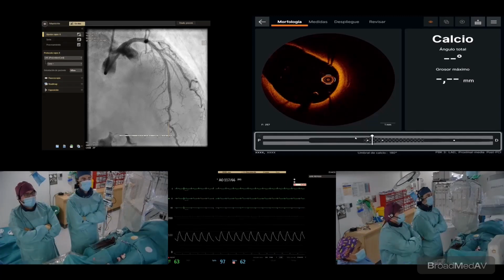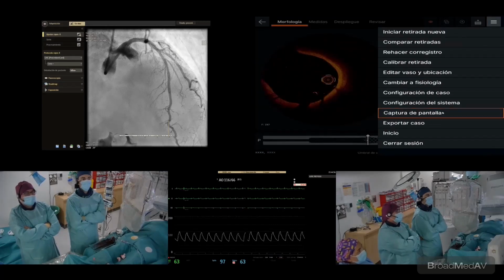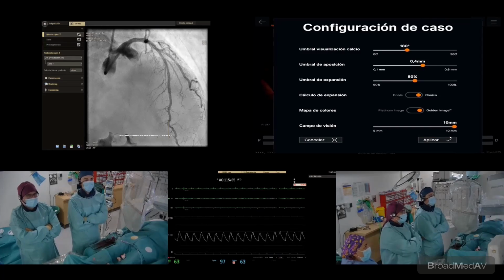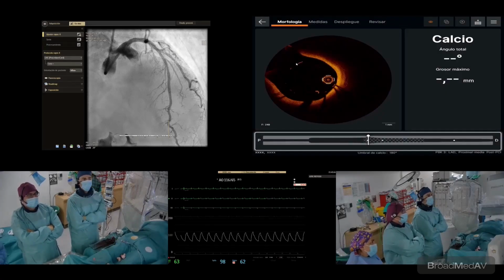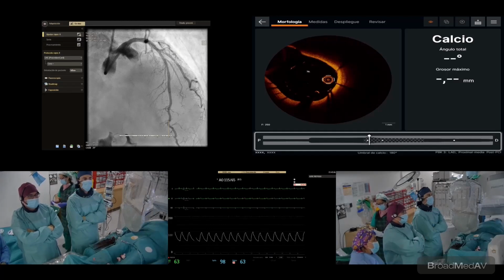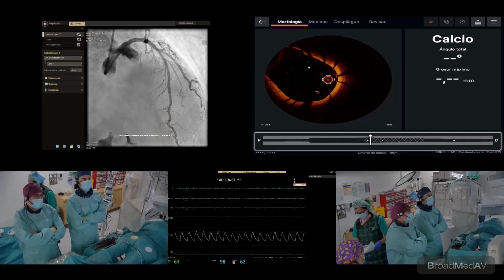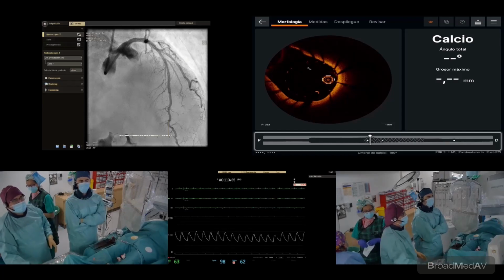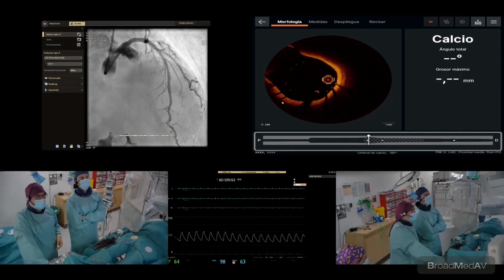There are some frames malapposed at the proximal part that we know that the outcomes are not as bad as the distal malapposition. The expansion is fine, and the thing is that we will need probably a very big and small balloon to oppose this part, and I think it's better to leave it like that. Yes, it's only 1 millimeter inside the left main. It's only 1 millimeter.